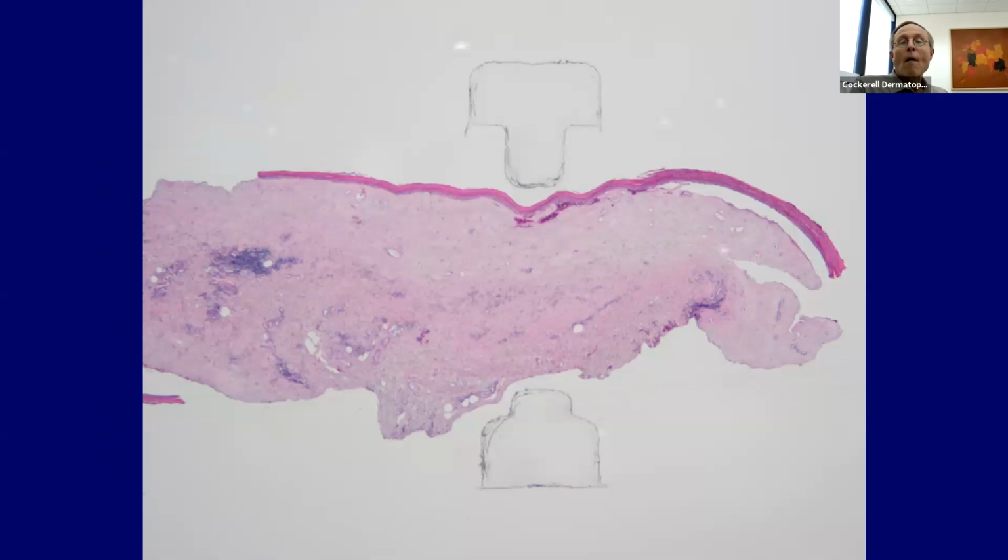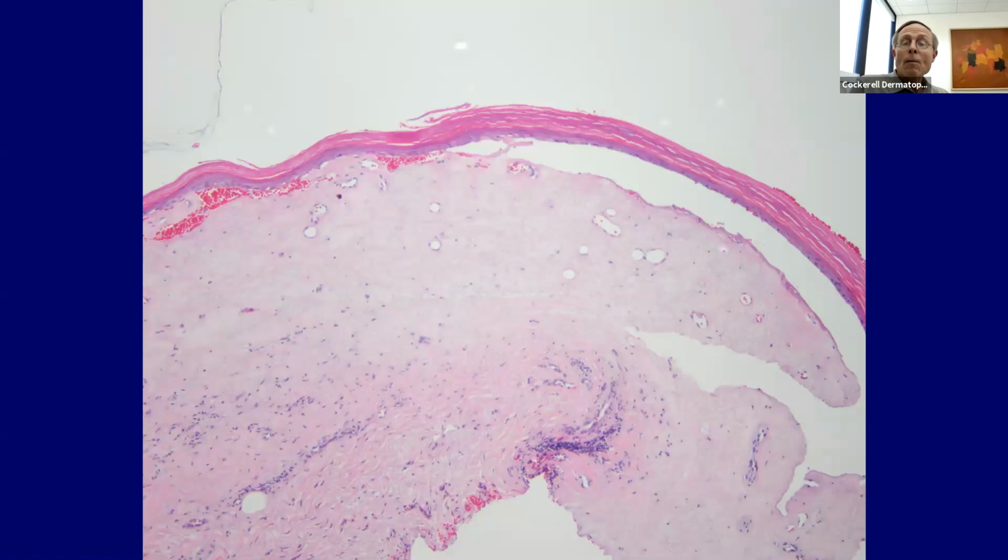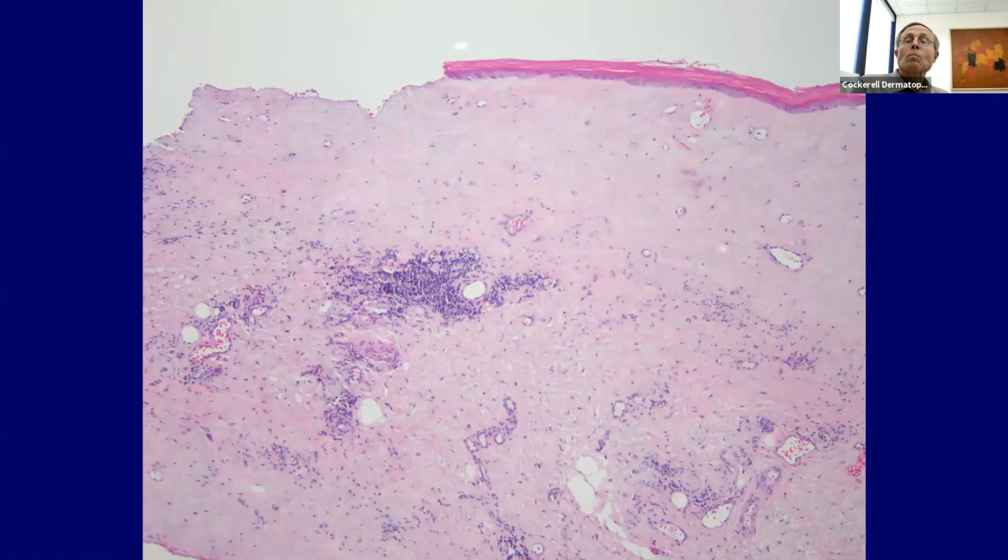Okay. Superficial punch, probably. And we've got an inflammatory process. Which of the 9 patterns of inflammatory disease are we looking at? We've got a superficial perivascular infiltrate here, probably some lymphocytes. We've also got some abnormality going on in the papillary dermis and maybe the reticular dermis, but mostly the papillary dermis. And now, what reaction pattern are we seeing here? Yeah, well, you've got LSA, but your reaction pattern is sclerosus.